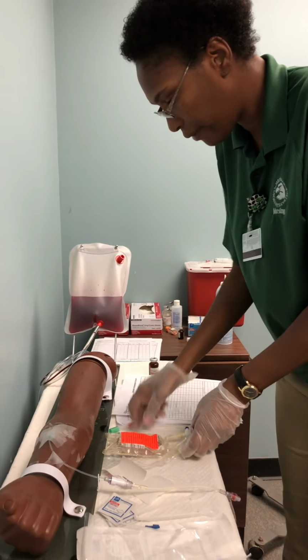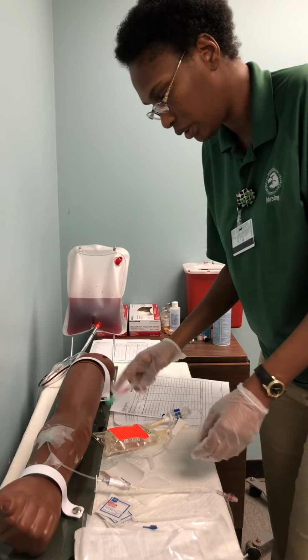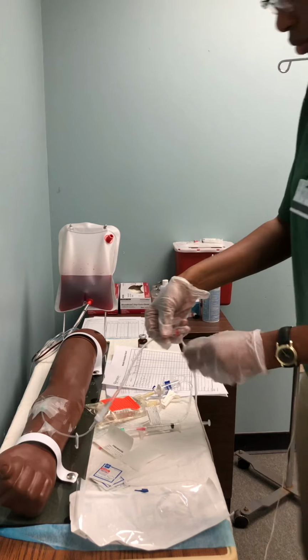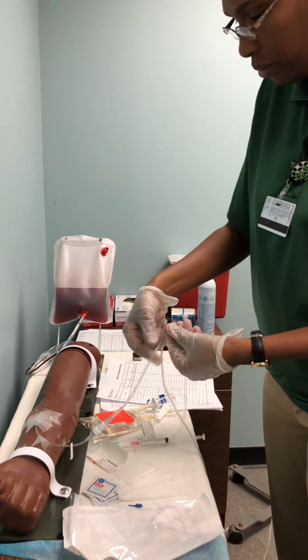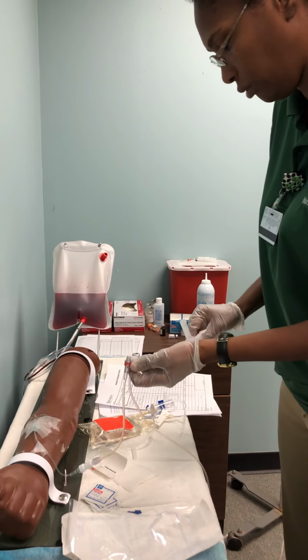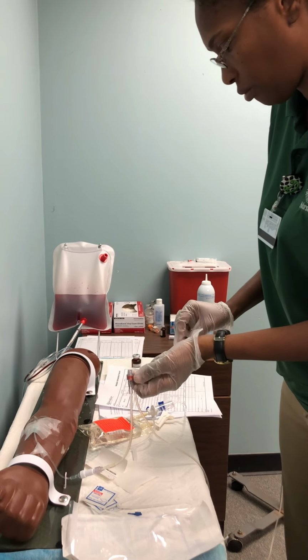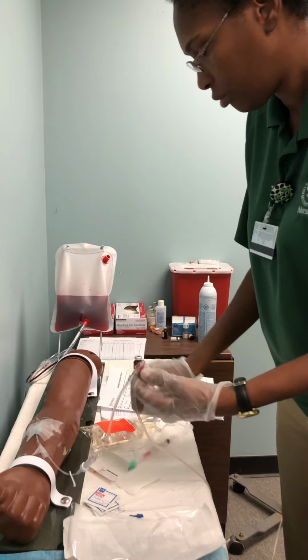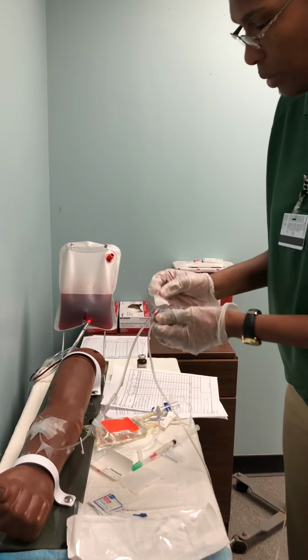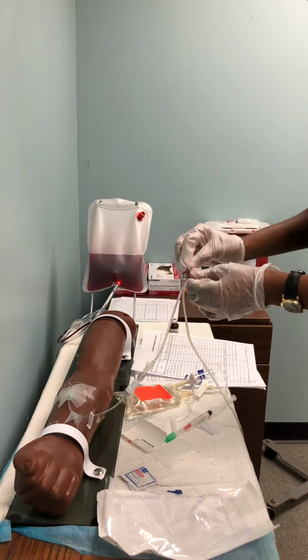I'm going to give my IV push medication first. I'm going to clamp the tubing on the side with the primary bag. I'm going to clean for 60 seconds.